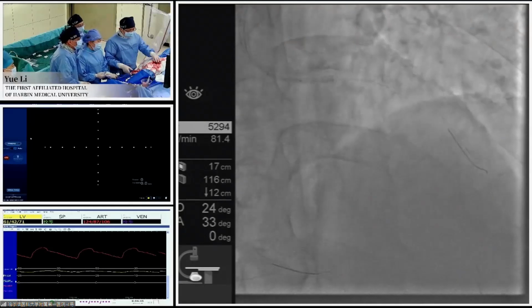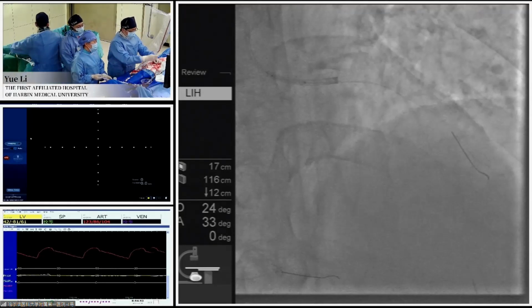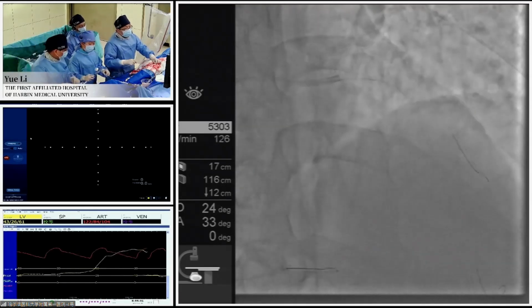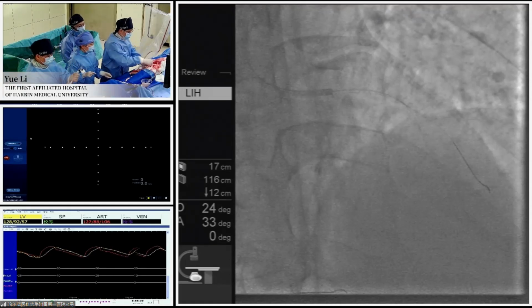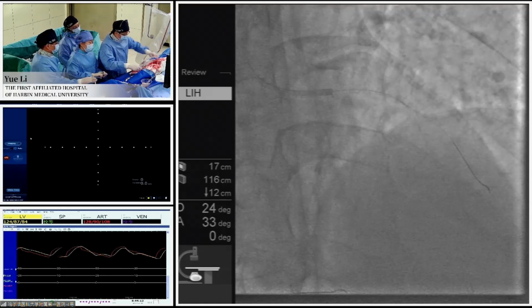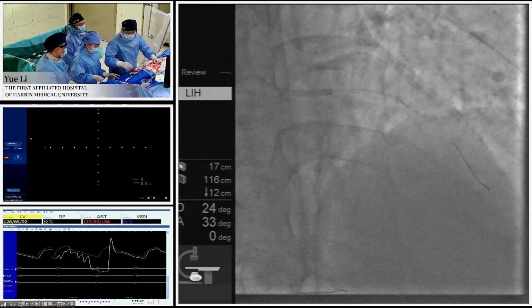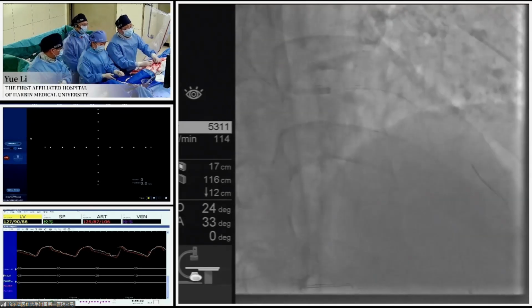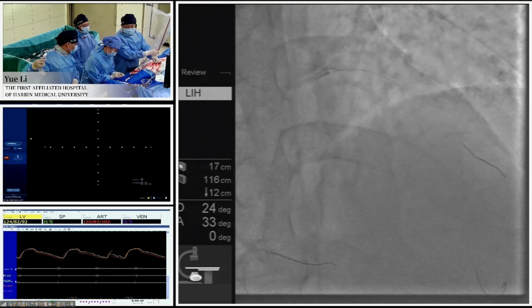However, since the CT angiography reconstruction confirmed that the plaque is a relatively soft fibrotic plaque, retrograde through the septal channel relatively easily goes upward from the retrograde side. We can see the Gaia first successfully penetrated the retrograde cap. From the previous manuscript, we understand that the distal cap of the CTO segment is the majority of the time relatively soft compared to the proximal cap, because of the flow from the antegrade side. So Professor Li didn't continue to advance the retrograde wire, because after penetrating the distal cap, if you go up, sometimes the retrograde wire goes into the subintimal space.